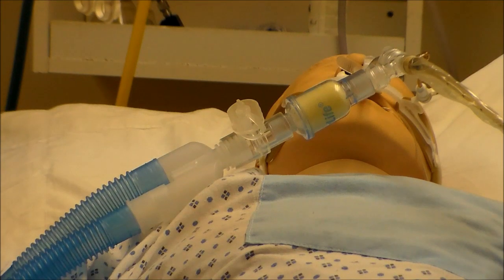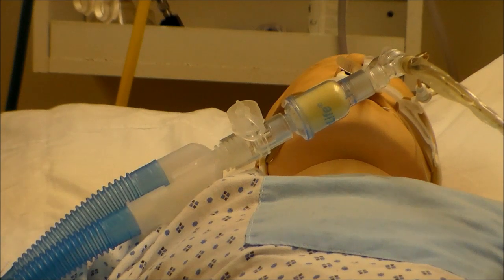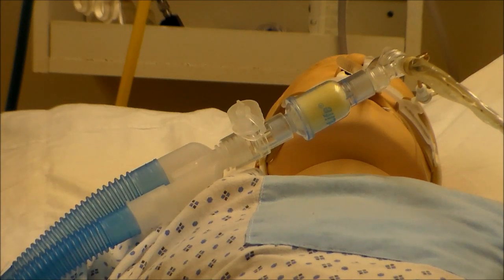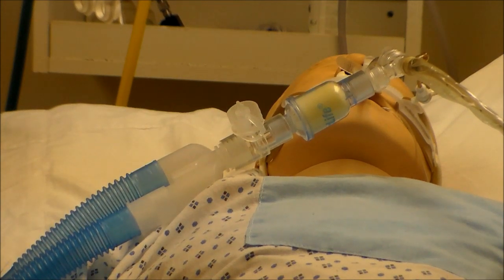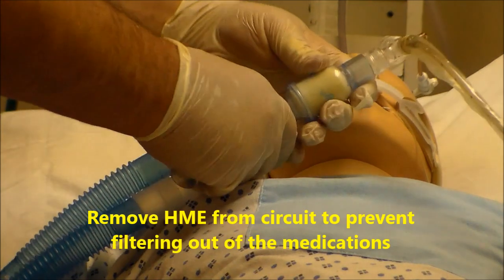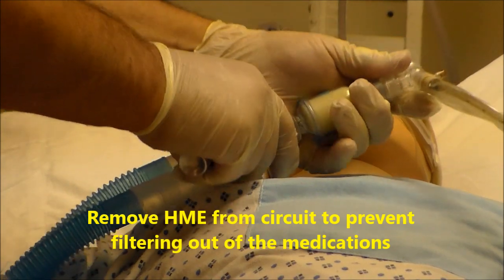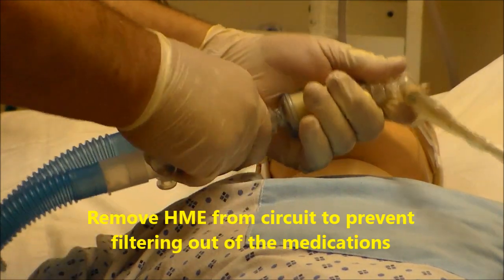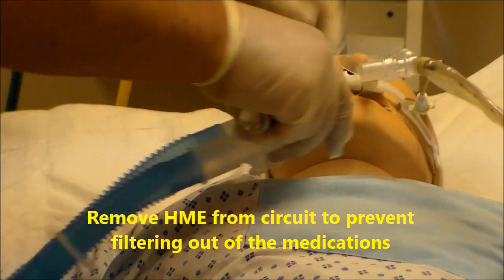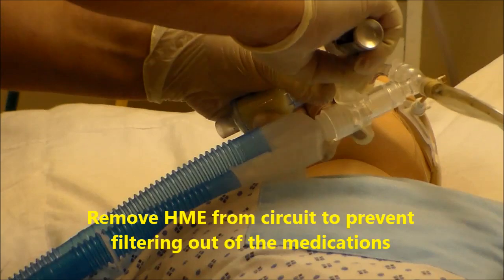Now we'll be doing an MDI through the vent circuit with a standard HME in line. The first thing to remember is after your adapter is in line, take out your HME and reconnect your circuit.